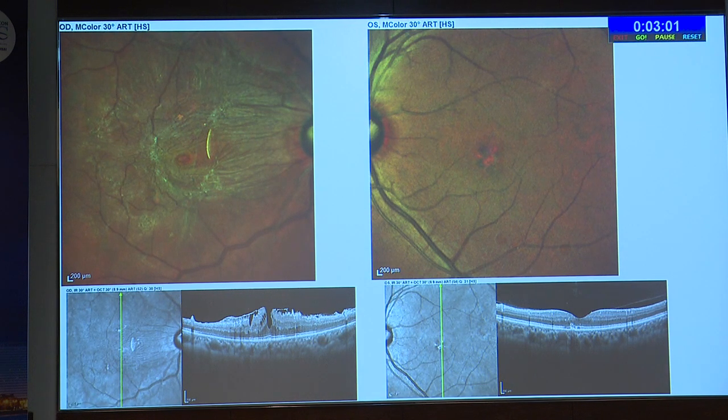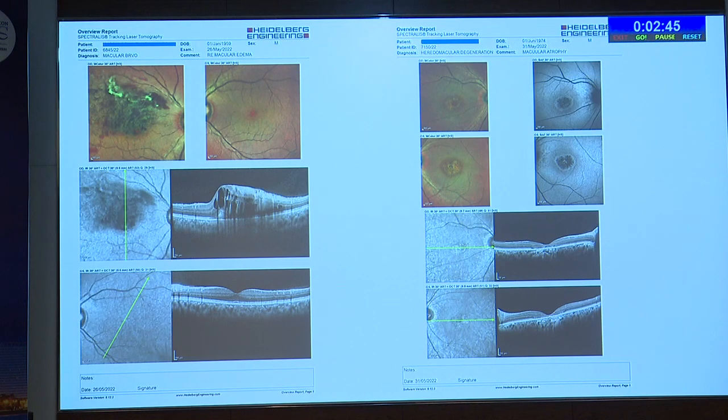So very small pathologies are missed by the ultra wide field imaging. The true advantage of ultra wide field imaging is the periphery, but very small, minute pathologies of the macula can be missed sometimes. If the media is not clear or the fundus photograph is not clear, you can miss images. So this is the difference.